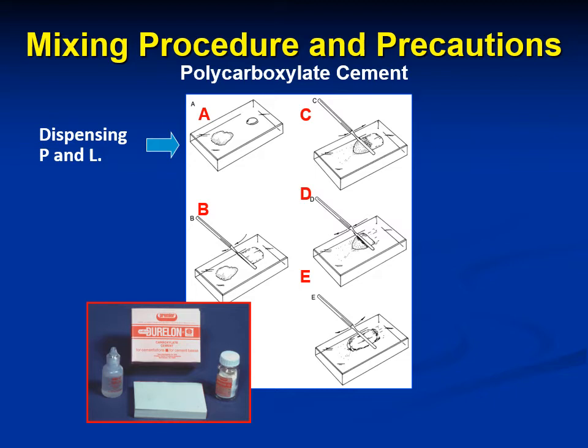Because the formed matrix is a gel matrix and it is a weak matrix. This is to prevent destruction of the gel matrix when it is formed.